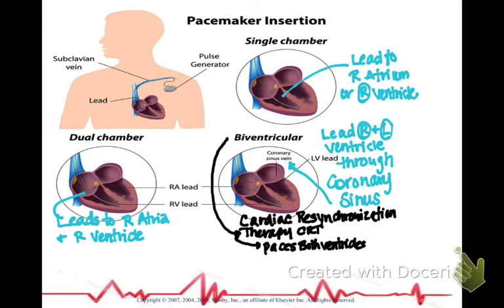Your cardiac resynchronization paces both ventricles. Biventricular. Bi means two. So these are just the different types.